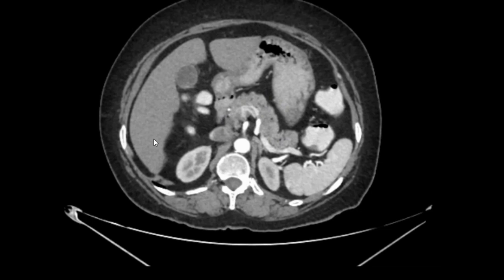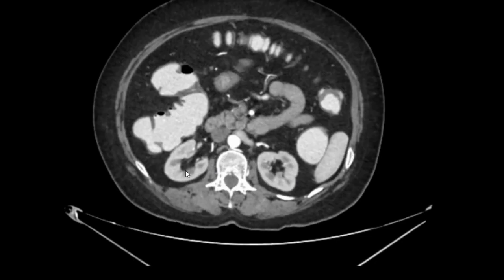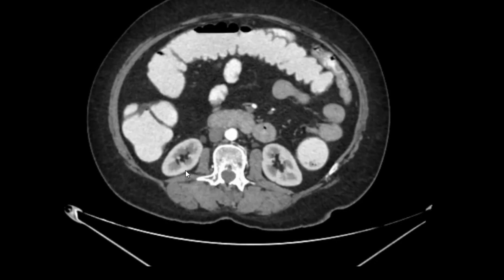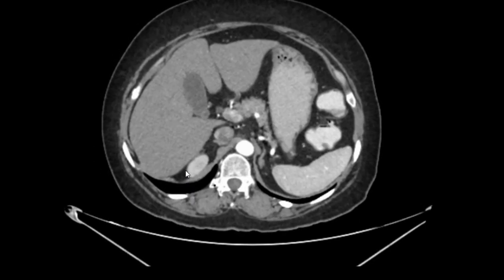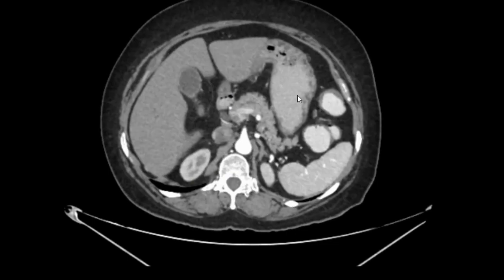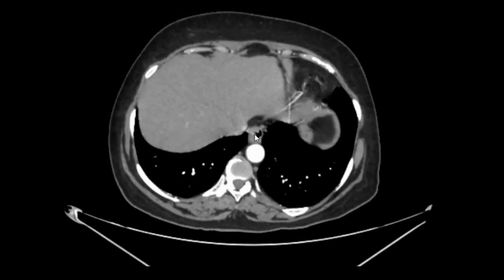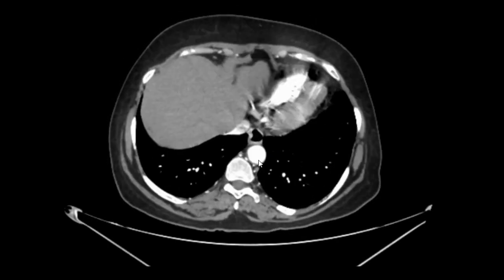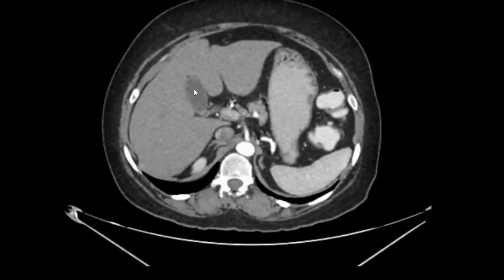Behind the liver and behind the spleen you can see two big structures — these are the kidneys. So that is your CT abdomen anatomy: the two kidneys, the spleen, the pancreas, the duodenum, the stomach, the esophagus, and the aorta. On the right side we have the liver and the gallbladder.